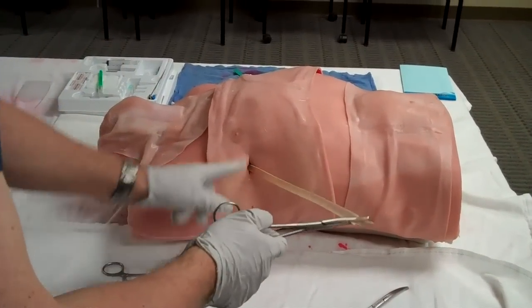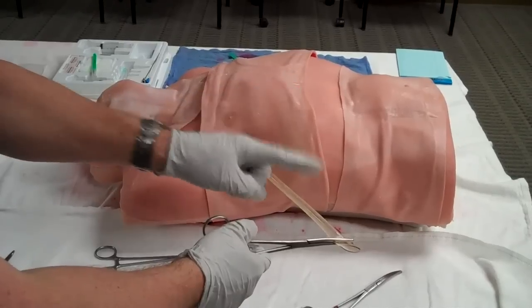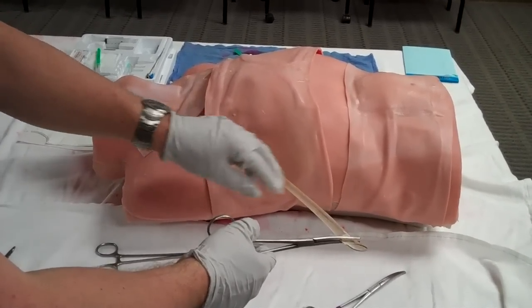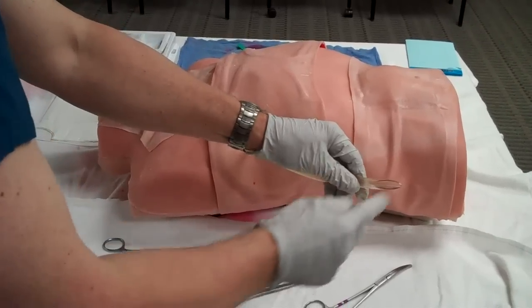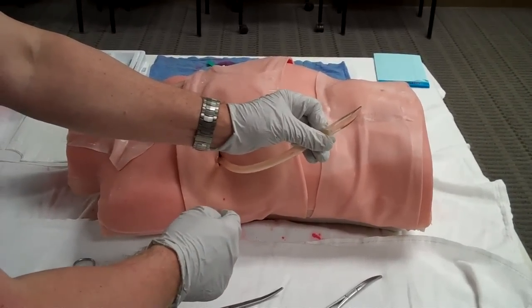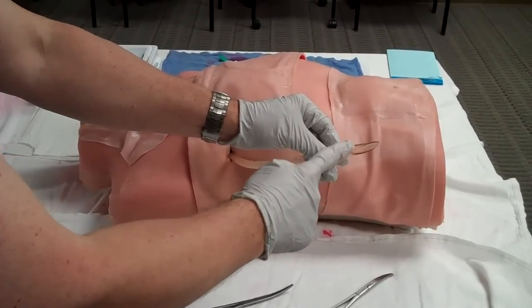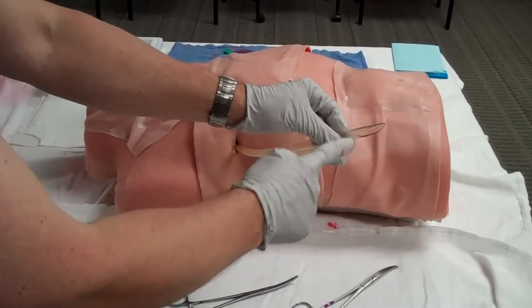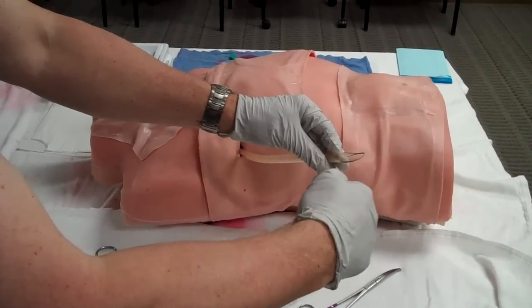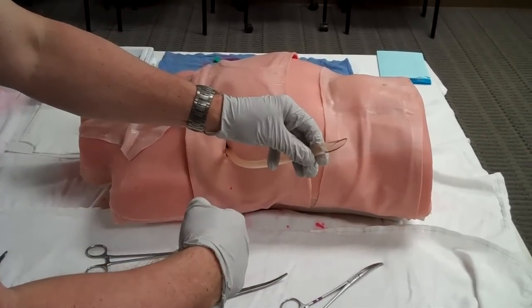So once the tube is in place, the hole is in the chest, it's time to do two things: hook up the collection system and sew it in. The collection systems, for some reason, all of these chest tubes have this weird end on them that does not fit well into collection systems. So most people will actually cut this with scissors so it's straight across or ever so slightly beveled so that the Christmas tree connector on the end of the chest tube system will actually fit into there very nicely.